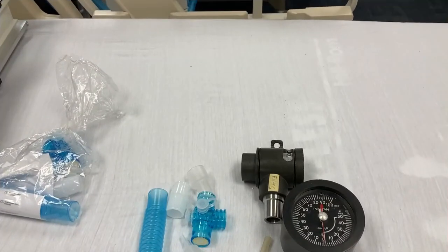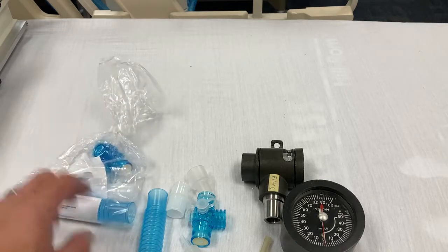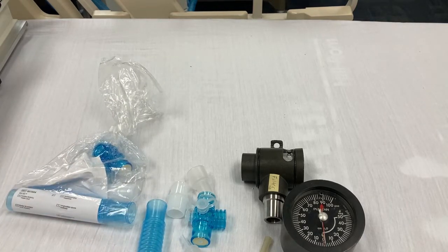All right, so this is the area where we're going to show you the parameter kit. Now, a lot of people, especially nowadays, because they put these functions on the ventilators themselves, don't use these anymore. But it's good to have these in case that's all you have. Plus, if you're out on the floors on a non-intubated patient, you'll need to know how to work this parameter kit if you don't have an automated digital type.